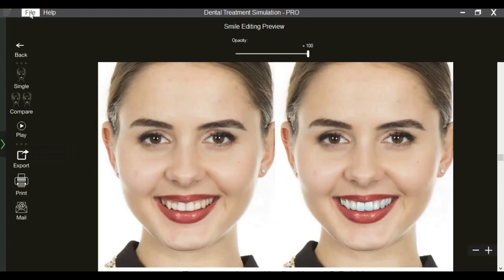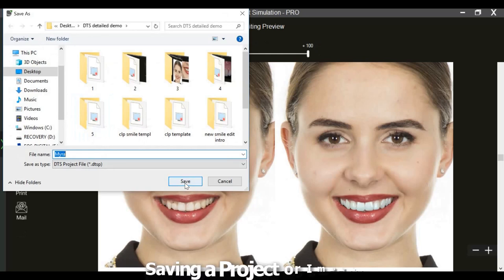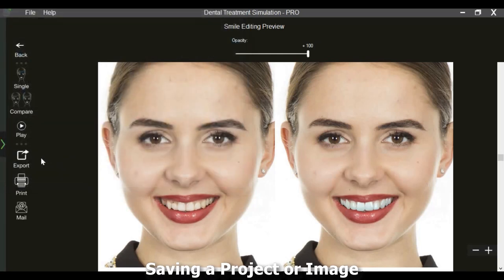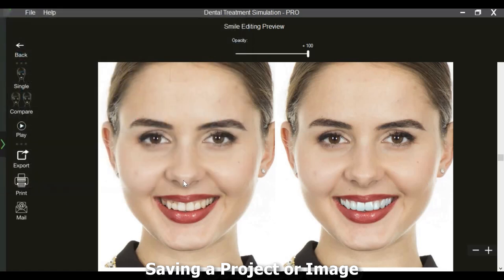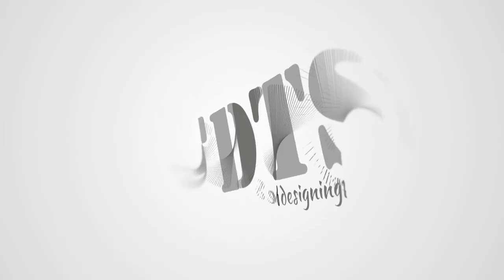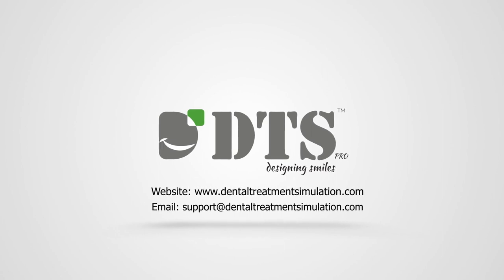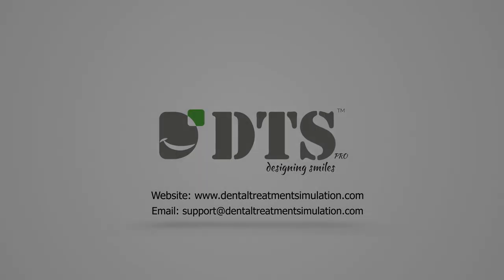All the simulated designs and templates can be saved in the form of a project file that can be shared with fellow colleagues and team members. DTS Pro is a simple-to-learn and easy-to-use software. Detailed video training tutorials are available on our website. For more details, please visit www.dentaltreatmentsimulation.com.